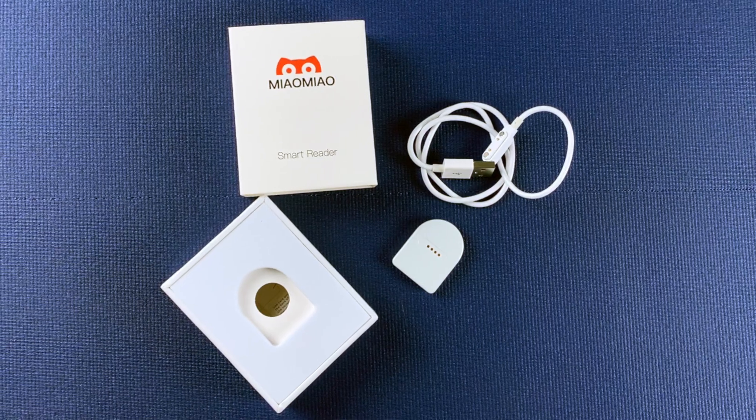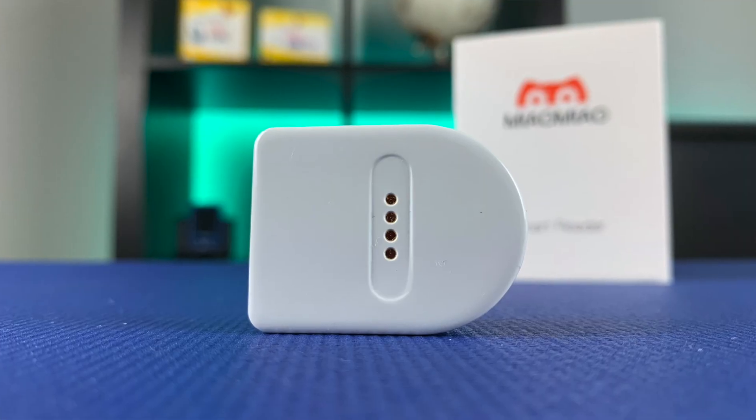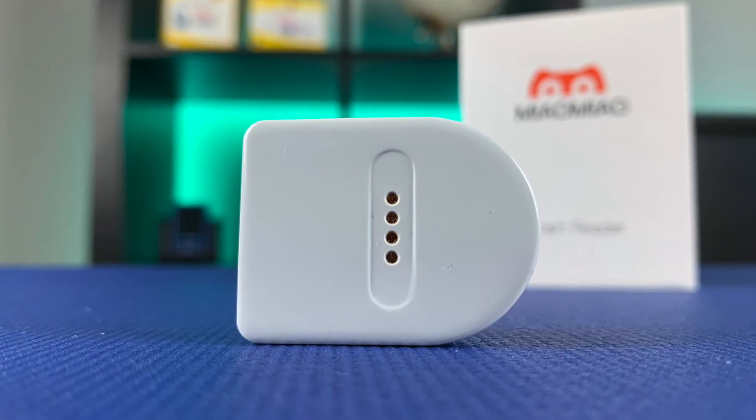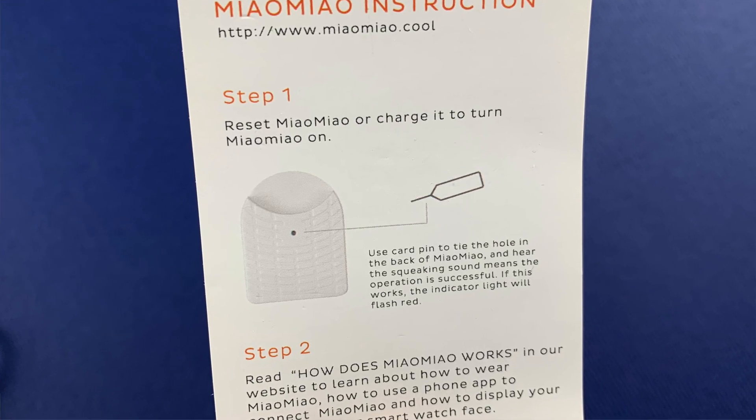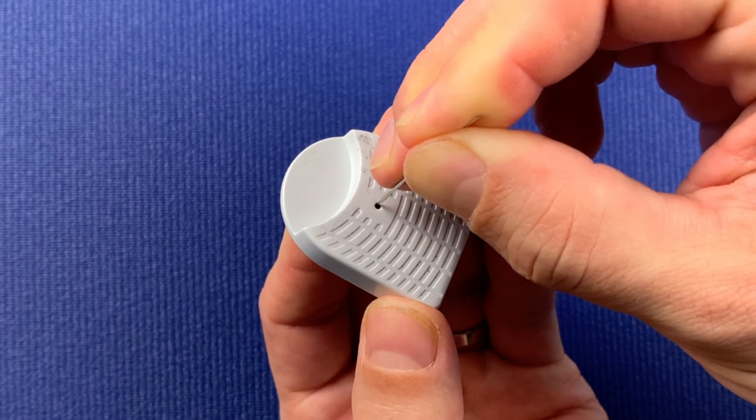To charge a transmitter from zero to fully charged takes approximately 2 to 3 hours. But if you charge it every time you install a new sensor, you will be done within 60 minutes, which anyway is the warm-up time of the sensor. You can also charge the battery while you have the transmitter on, because the charging pins are located on the front side. If you need to restart the Meow Meow, the restart button is located on the back side of the transmitter, so you will have to take the transmitter off to do that.